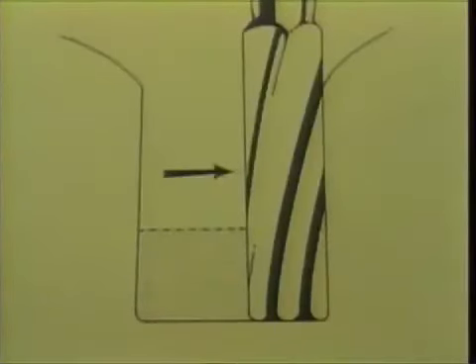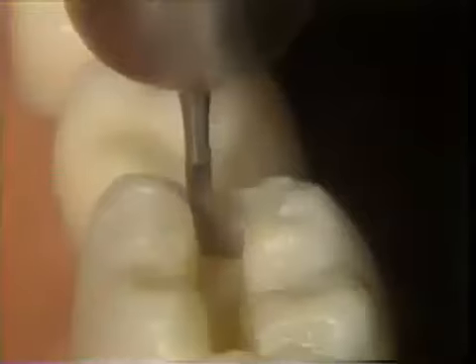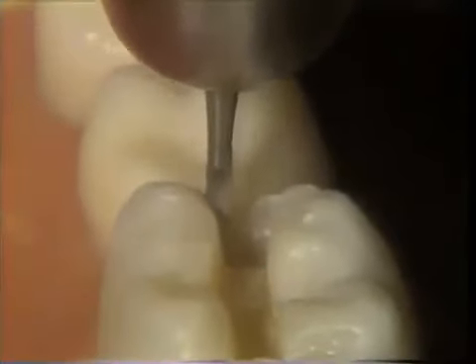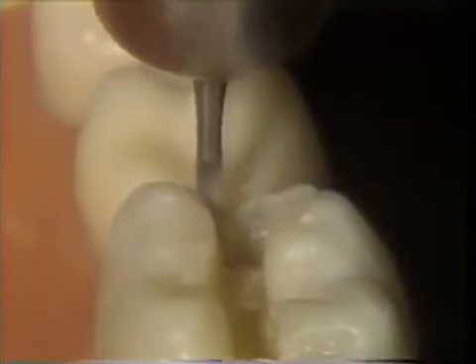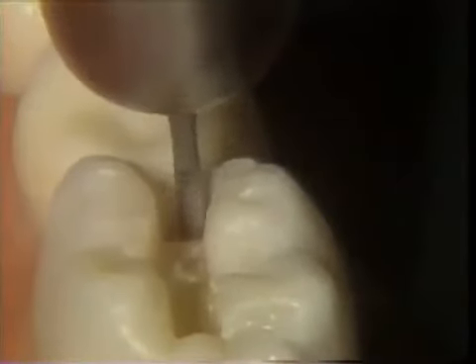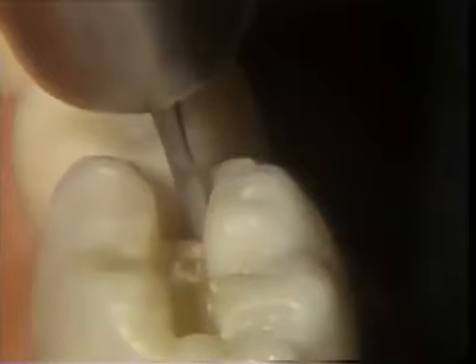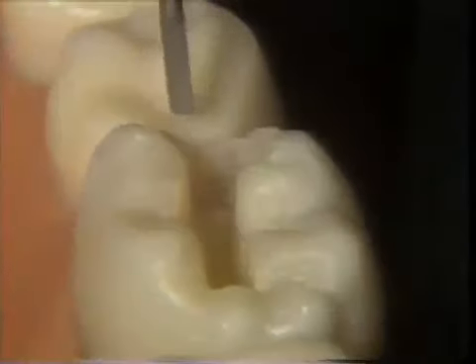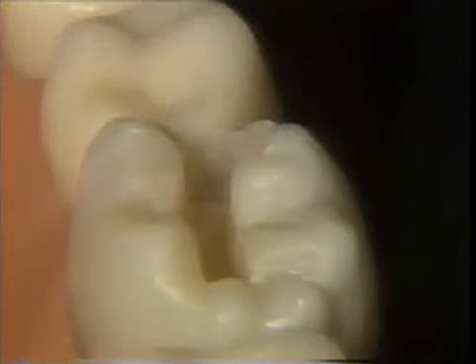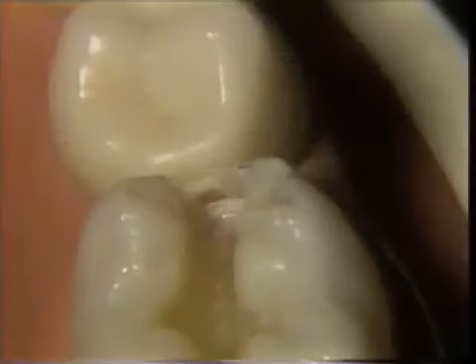The diagrammatic examples will now be demonstrated on the extracted tooth. The burr is placed into the prepared tooth, very lightly contacting the cervical floor, and as the burr is moved buccally, it is positioned so it will produce an inverse taper on this proximal wall. The lingual wall is prepared in the same manner. The marginal ridge is now thinned even more. Very often, as is demonstrated here, a piece of the thin marginal ridge will break away. This creates no problem. Note the hole in the marginal ridge.